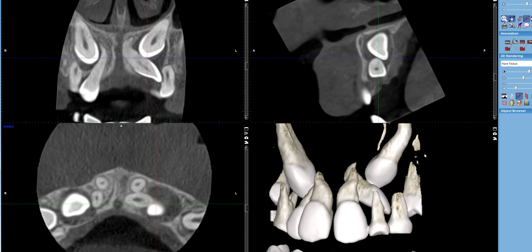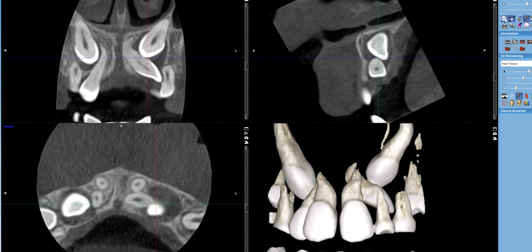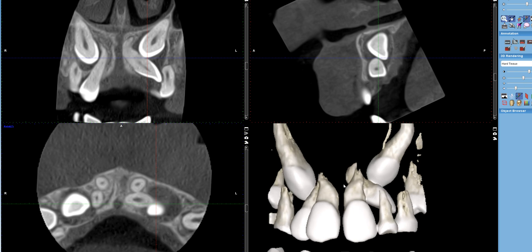This information is extremely helpful for students and faculty if they are asked to expose these canines. In order to do that, they have to know the precise locations of these two canines, and most likely they're going to have to approach palatally — measuring the distance from a reliable landmark such as the incisal edge of the central or the CEJ of the central. They would create a window to expose the canine and place a bracket in order to bring down the canine. Such an interesting case, the way it has caused dilaceration of the adjacent lateral incisors.